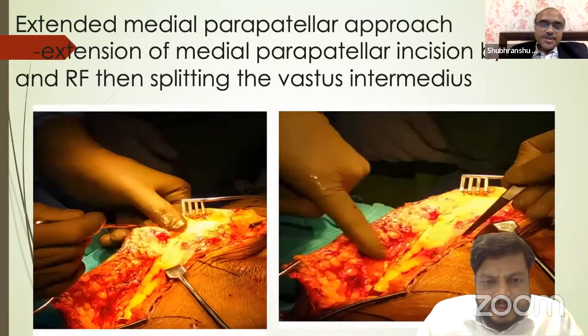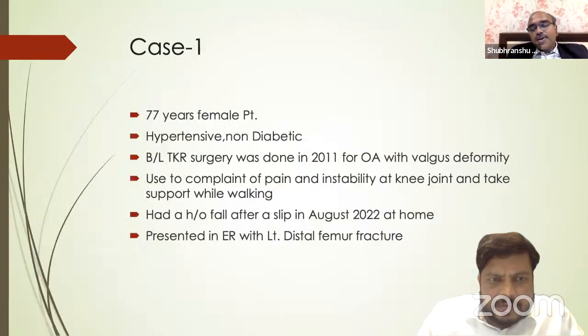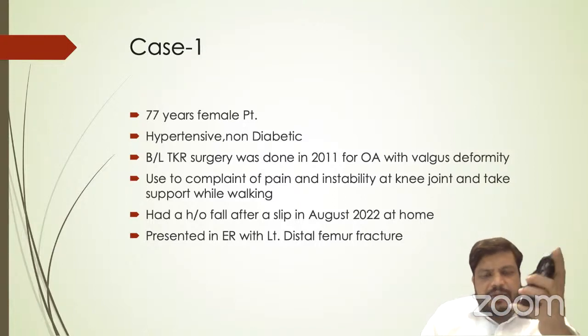Nowadays, segmental defects are better filled with sleeves and cones rather than putting wedges and hemi blocks. Now we have almost stopped using hemi blocks and wedges. We are using sleeves because that provides better metaphyseal-diaphyseal fixation. Okay. So, sir, is my screen visible?